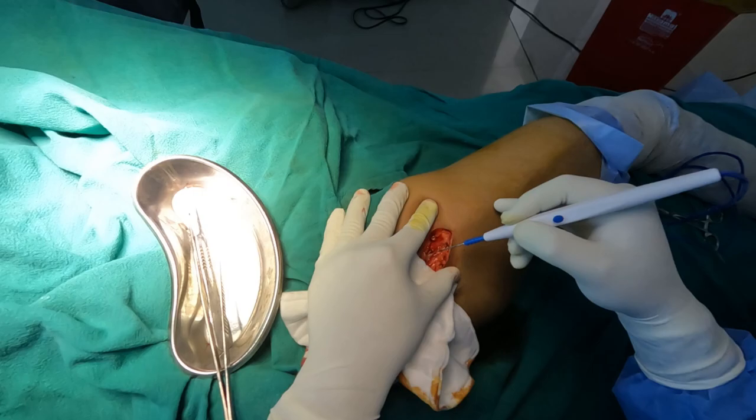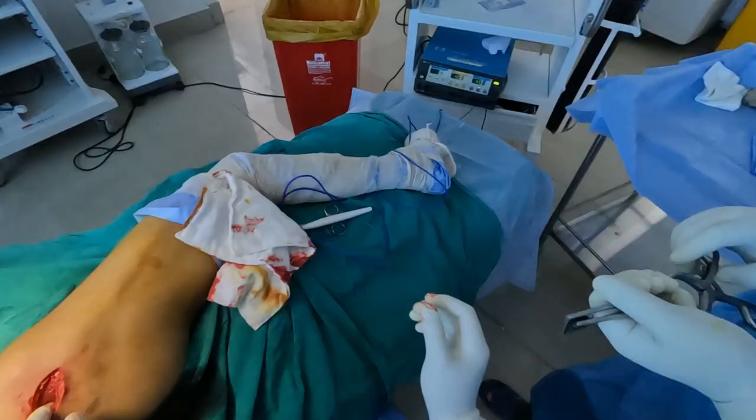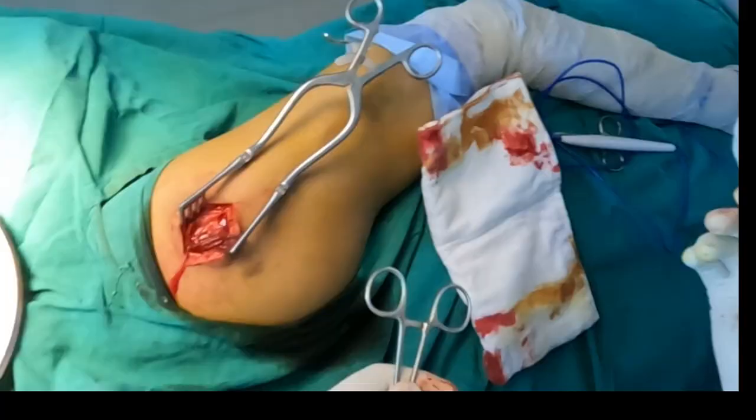Here I am making a small rent in the tensor fascia lata and opening it with the help of a dissecting scissor. Once the tensor fascia lata has been opened, it can be retracted with the help of a self-retaining retractor.